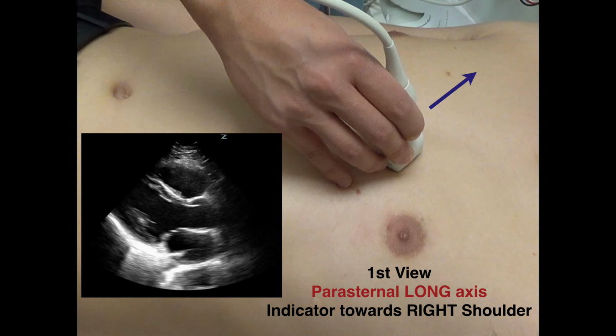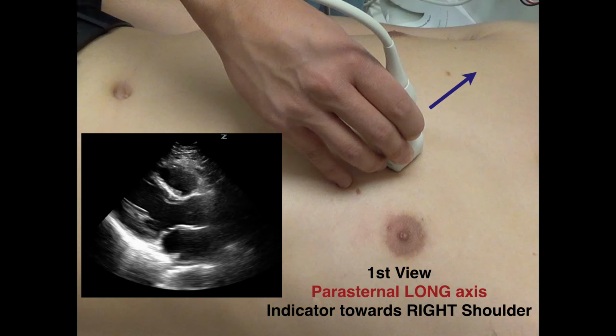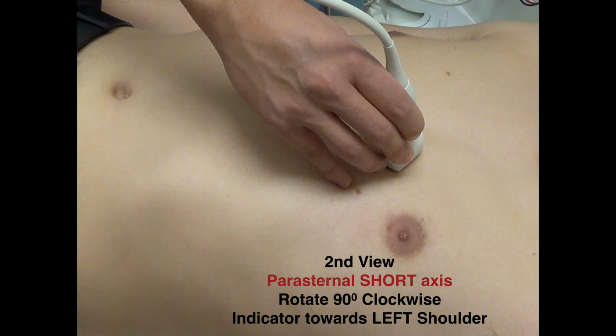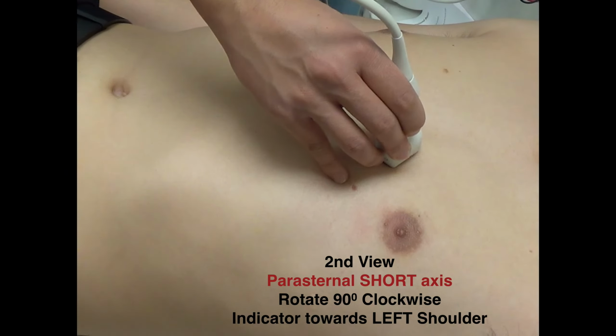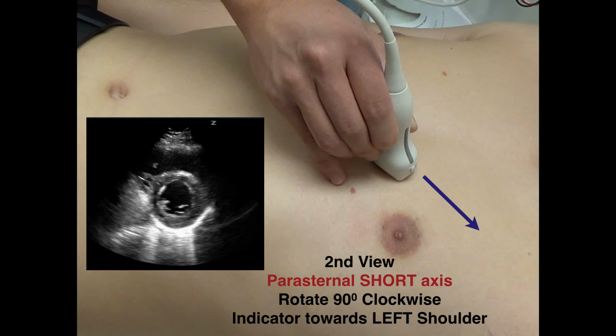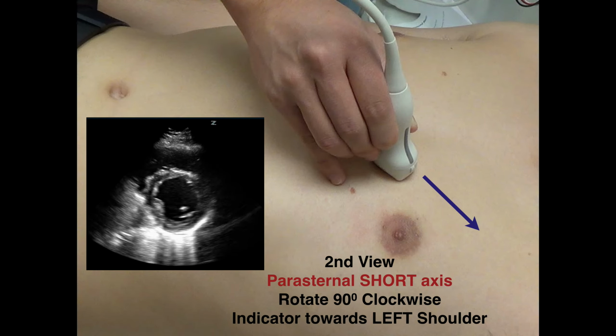So putting it all together, we went through a lot, but here's how everything looks. Initially, the indicator is towards the patient's right shoulder, and you get the parasternal long axis view. For the second view, remember, you rotate 90 degrees clockwise, and the indicator is going to be towards the left shoulder. You can see that person moving the hand there. So now the indicator is towards the left shoulder, and that's how it would look.